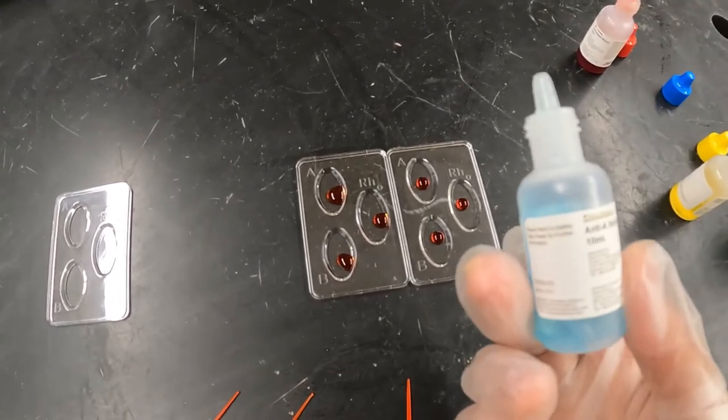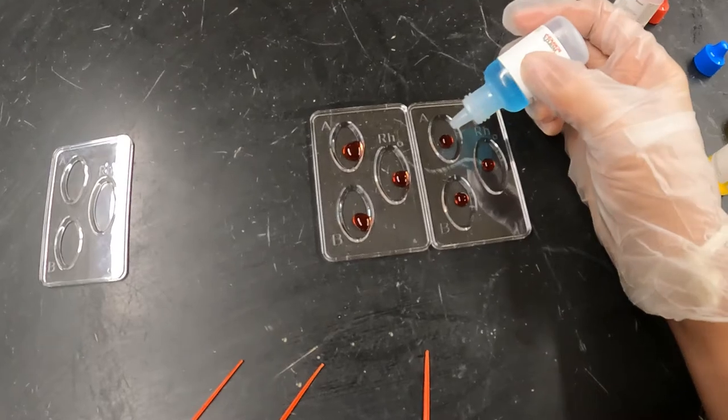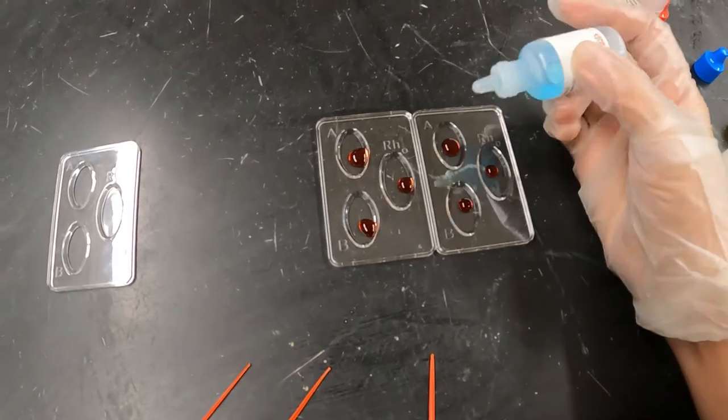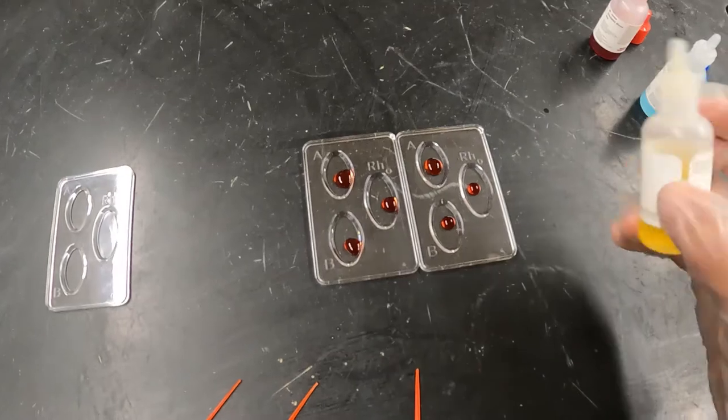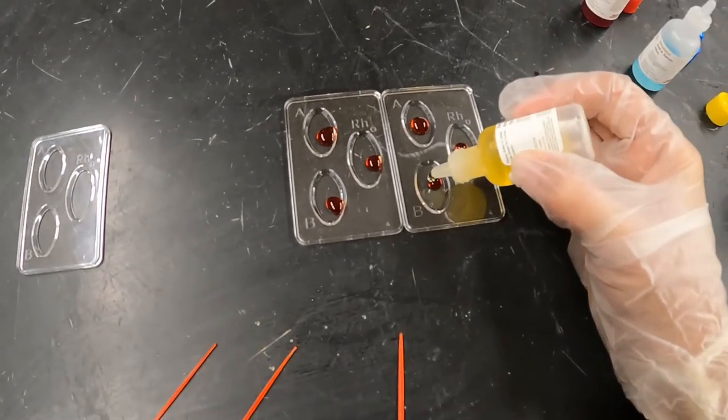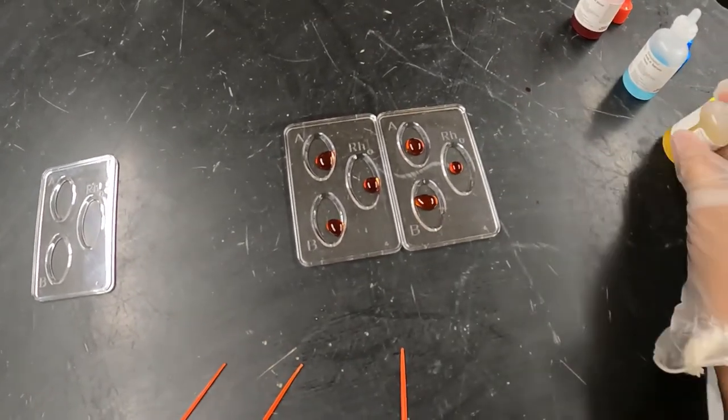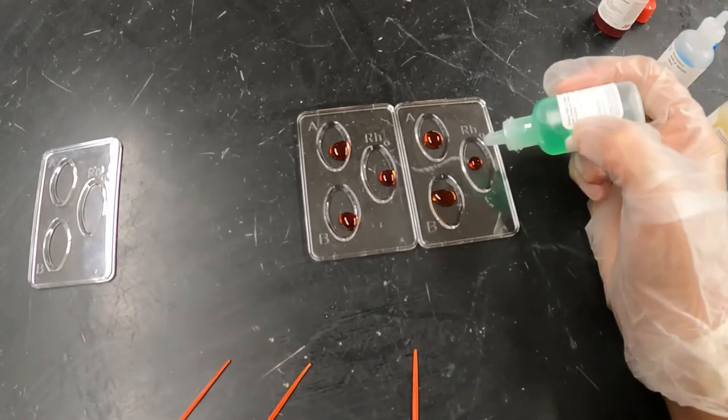Then you're going to take the anti-serum and place it on the correct well. Don't touch it to the well, but a couple of drops inside for each. So I put my anti-serum for A, putting in my anti-serum for B, and then I'm putting my anti-RH.